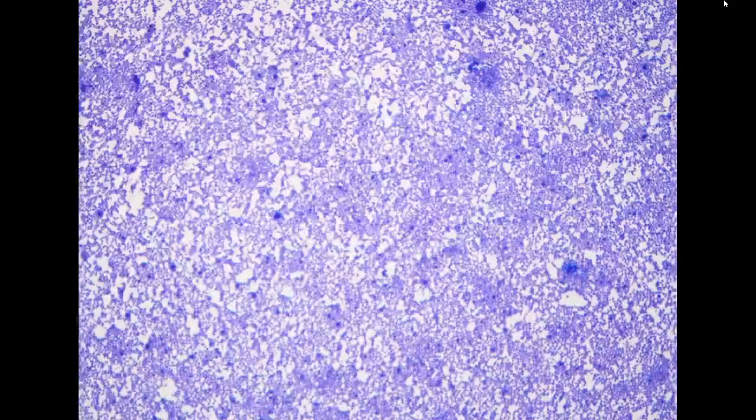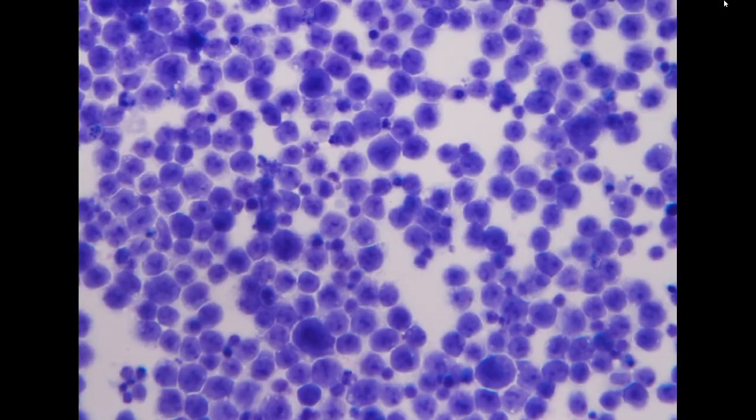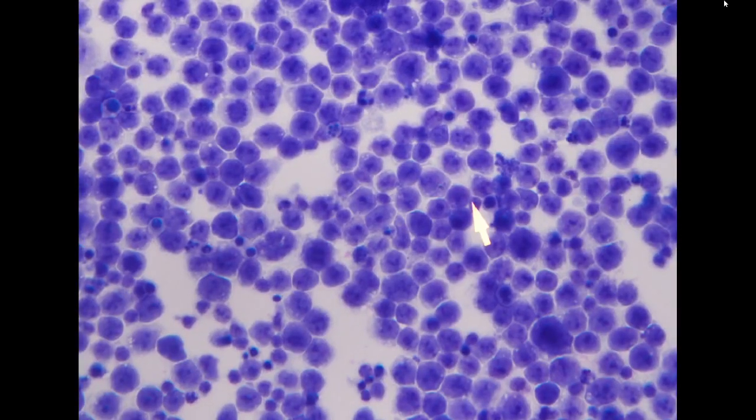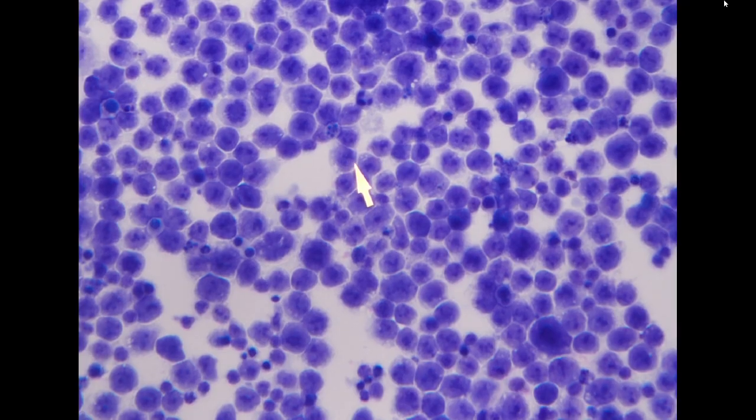And if we take a look at the Diff-Quik, here we can appreciate the cytoplasm of the cells. Sometimes it has very tiny fat vacuoles. For higher grade lymphoma, it is common to see these fat droplets inside the cytoplasm, for example, Burkitt lymphoma, some diffuse large B-cell lymphoma. Also, primary effusion lymphoma is within the spectrum of large B-cell lymphoma.